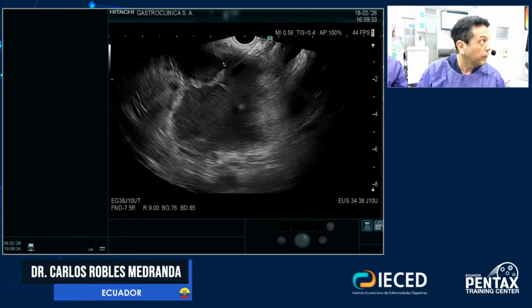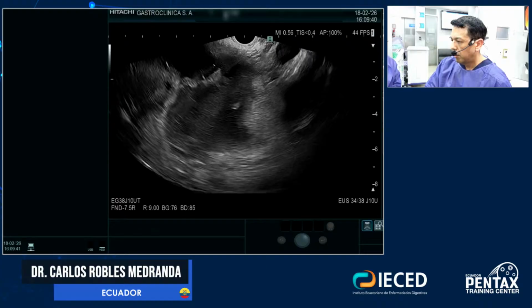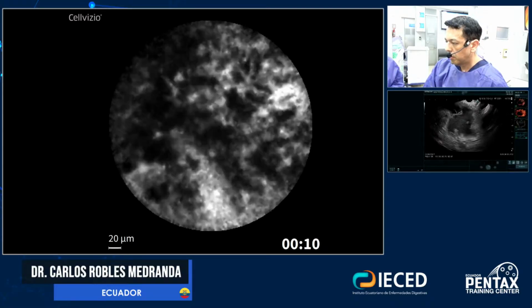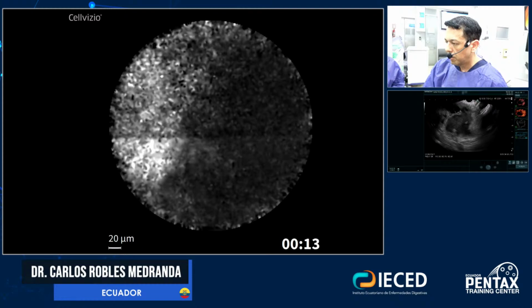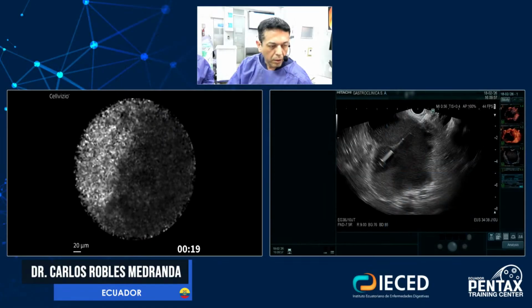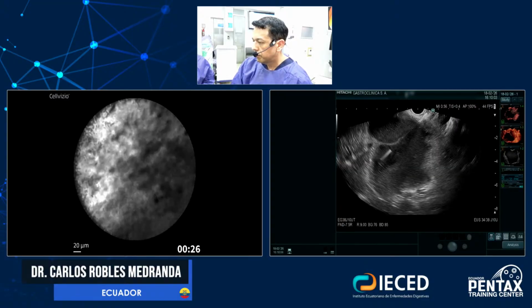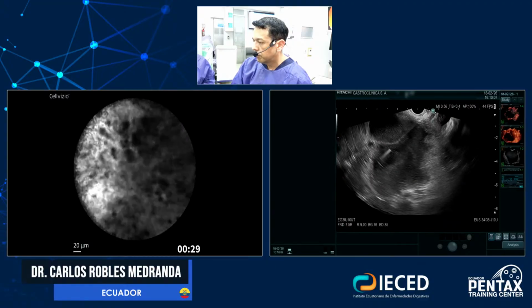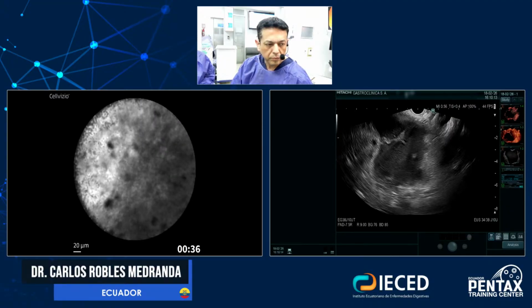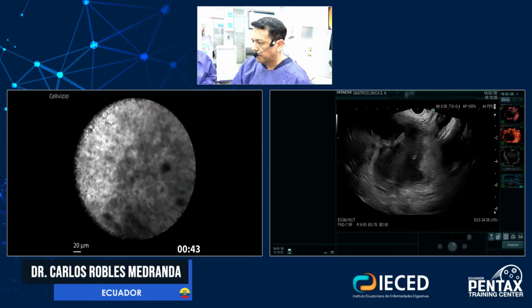We pass the contrast. It looks... I think it's different, huh?